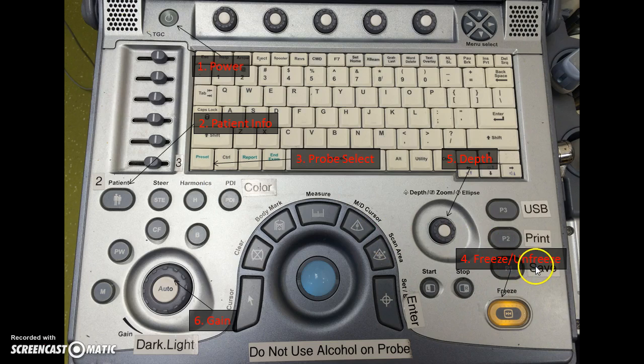Next is the freeze unfreeze button, and that's important because a lot of learners have difficulty saying, well, the image isn't moving, it's not working, and it's because the ultrasound, as you can see here, when lit up, is actually frozen. And so when this light is on, that means that the screen is frozen on the image that's present, and by clicking it, you can actually go back to live production.